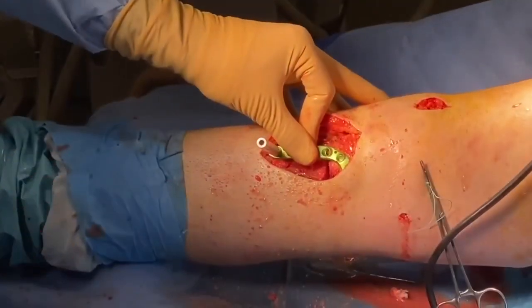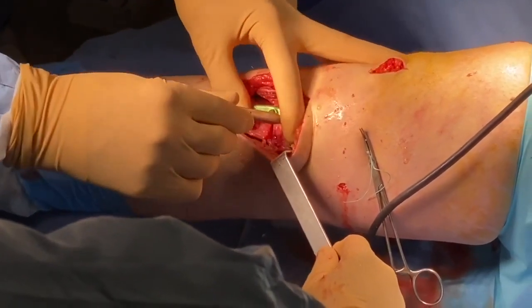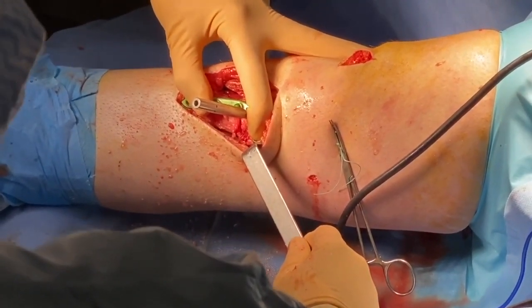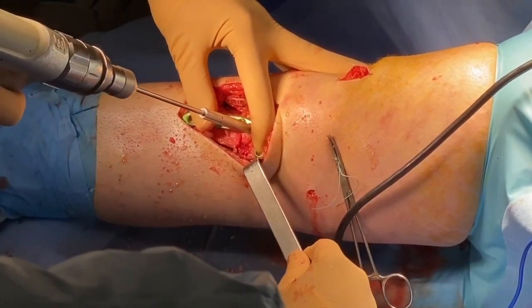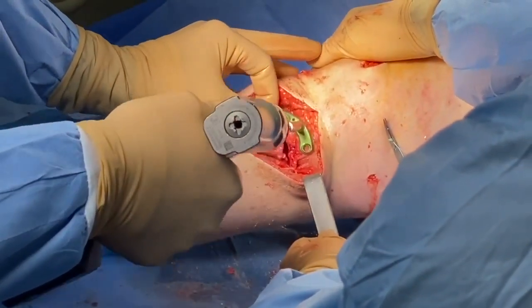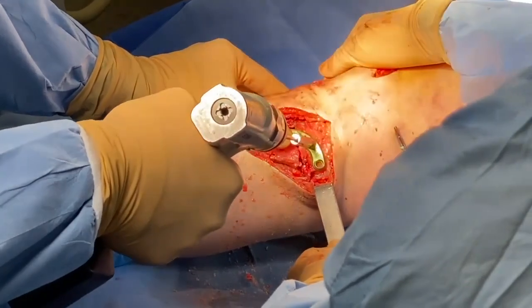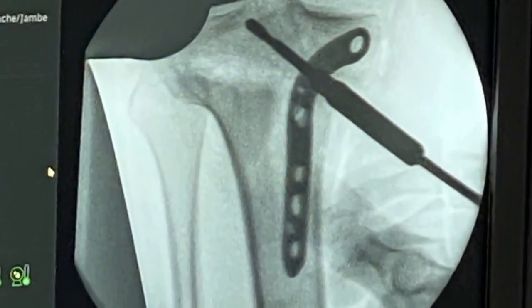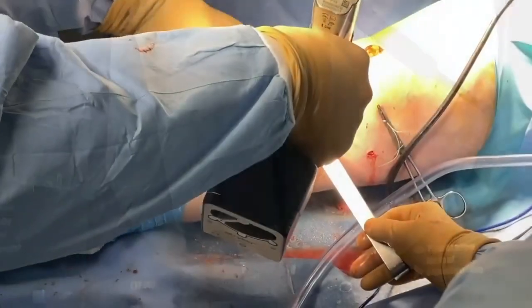When this step is acquired, we use a compressive plate specifically created for the ACL tunnels to be performed in between the proximal screws. We first secure the proximal aspect of the plate onto the bone without reducing the osteotomy. We use 3 locking screws. We verify the position and try to be as perfect as possible to avoid any conflict in between the plate and the medial tissues. When this is verified, after fluoroscopic control, we can then reduce the osteotomy site.